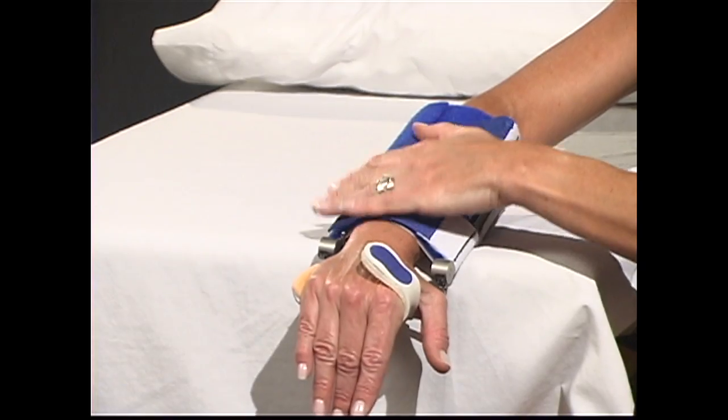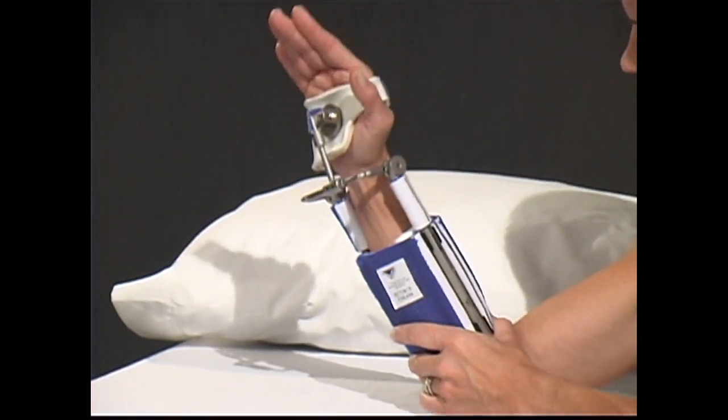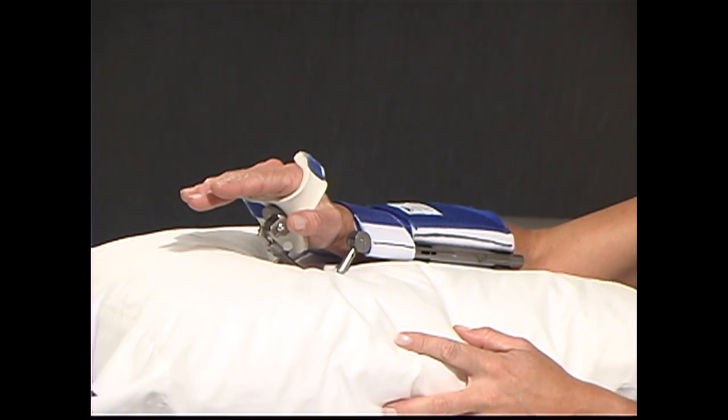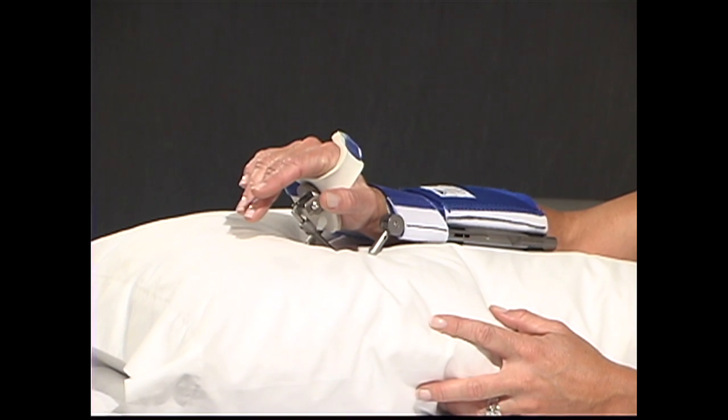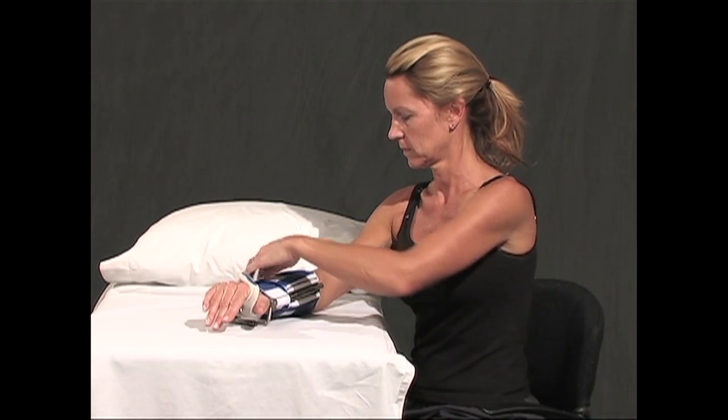Check cuffs for tightness. The patient should be inactive and relaxed while wearing the DynaSplint system. The most comfortable position while sleeping is with the arm supported on a pillow, or while sitting with the arm supported so that it's level with the heart.